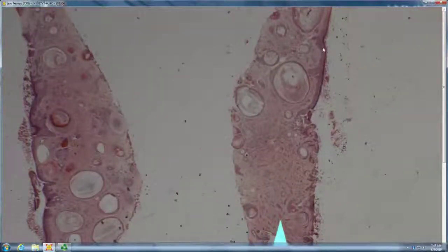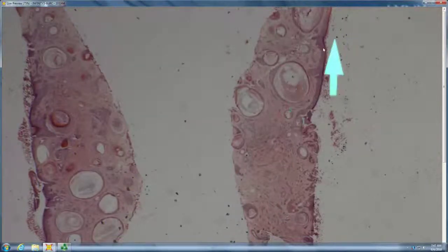Paisley tie pattern. Paisley tie pattern. See, I wore the wrong tie today. I should have worn a paisley tie, right? So, and it has a central dell and prominent horn cyst.